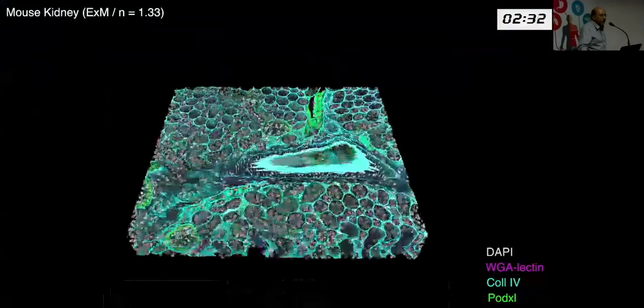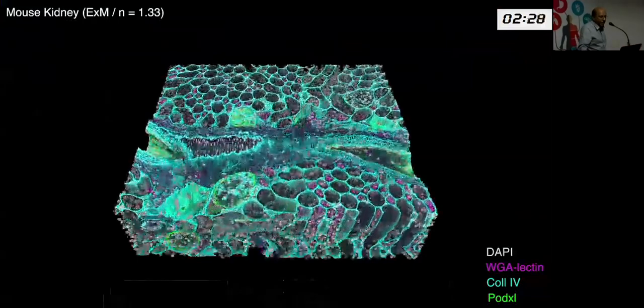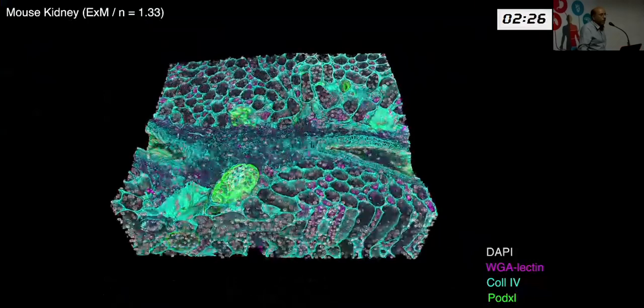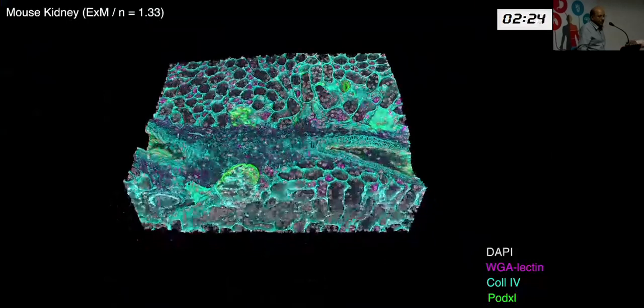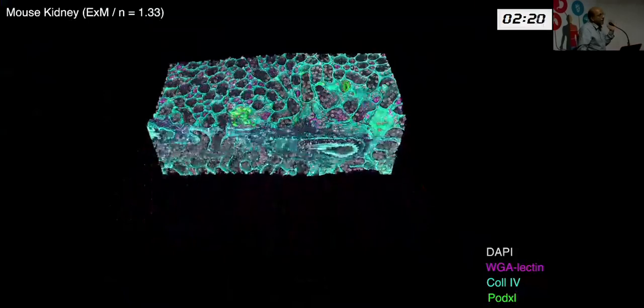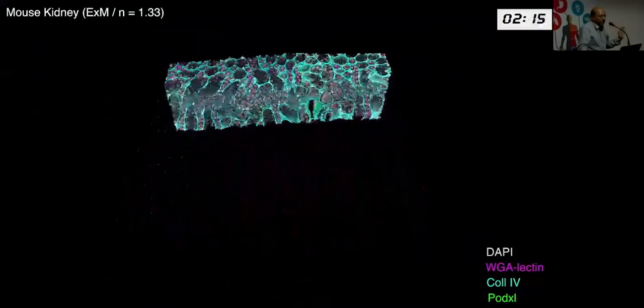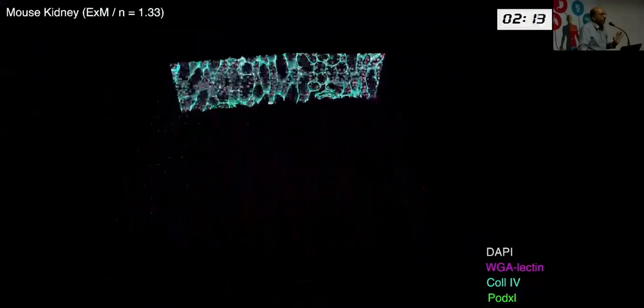Multi-stained kidney tissue looks... You would wonder what pathologists will have left to do, but this does add a definite phenomenal dimension to where the cells are co-located and what the pathology is likely to be. It's scanning the whole volume of tissue.